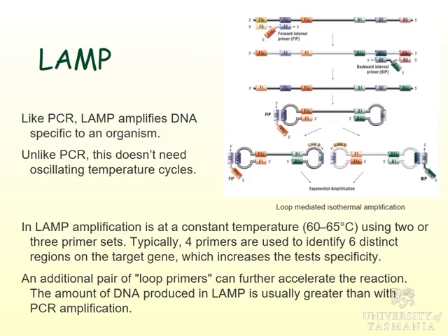What else can we do? There are other assays. This assay is relatively new, been going for a decade or so. Again, it amplifies DNA. It's called LAMP. And what does LAMP stand for? Oh, I've forgotten. Whoops. I'll tell you next time. It amplifies DNA from an organism.